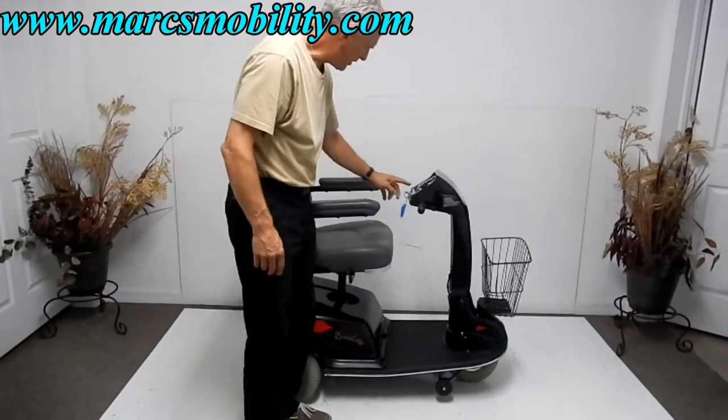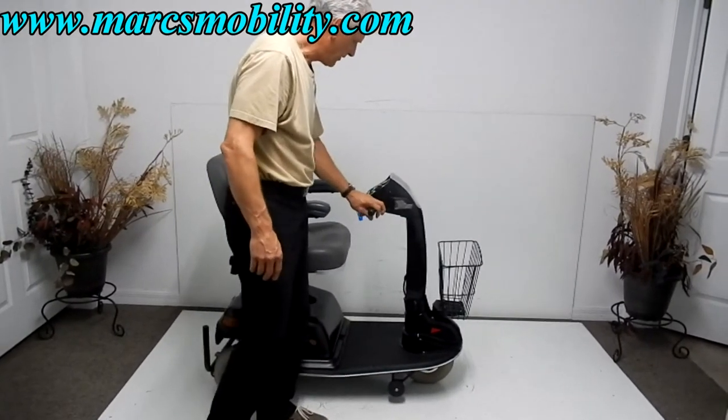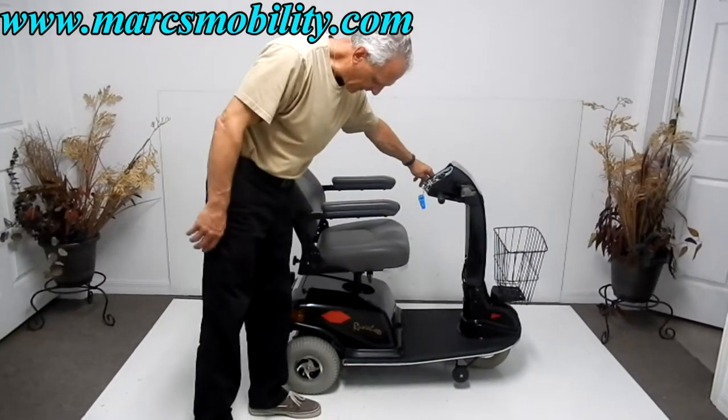A lot of people like this elevation feature. To bring the seat back down, you have to put it back in the seat mode first, then hit the other side of the control, and the seat will go back down.